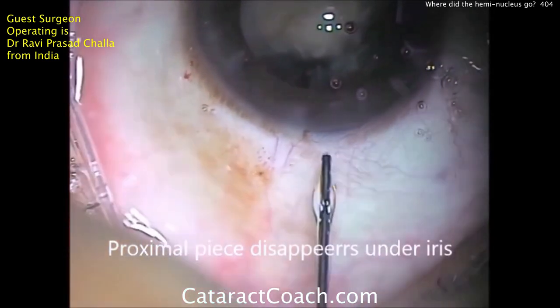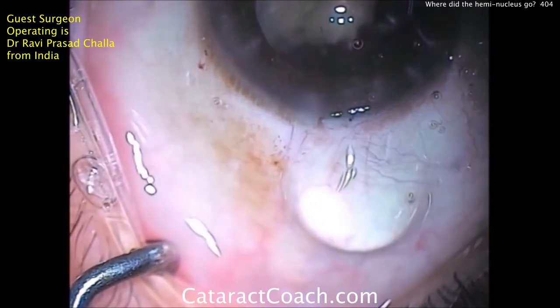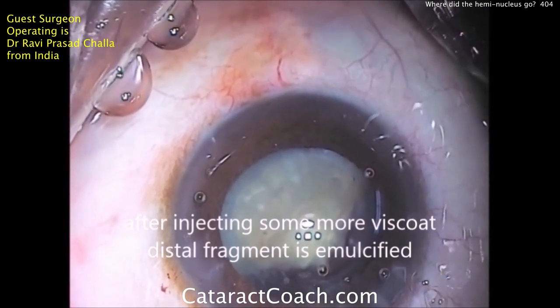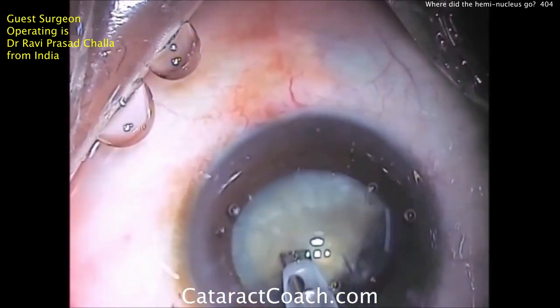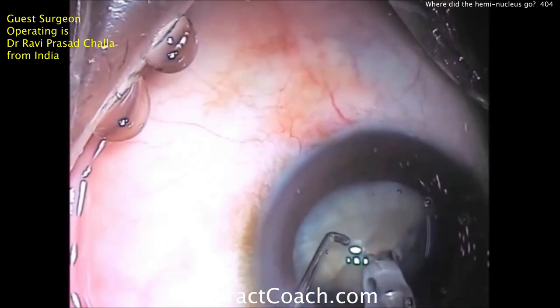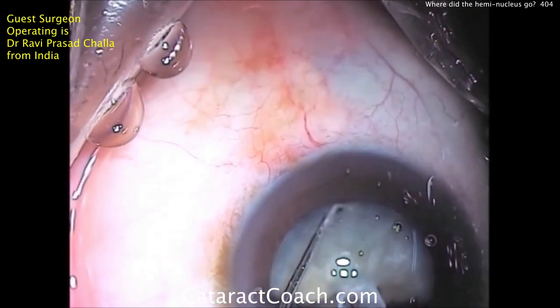But where's the proximal heminucleus? It's under the iris in the sub-incisional space. Where did the heminucleus go? Well, half of the heminucleus has gone through a defect at the capsular bag equator — specifically the sub-incisional capsular bag equator.